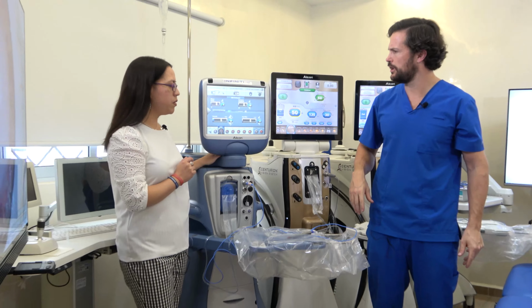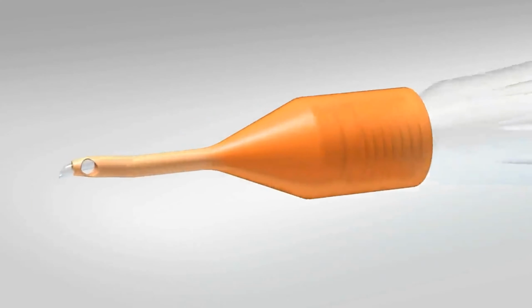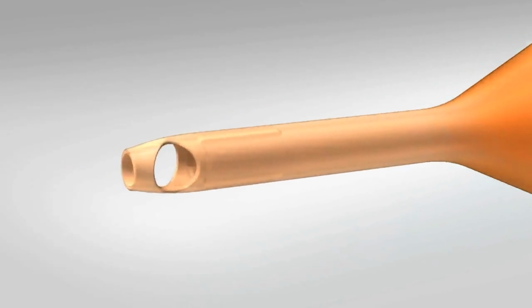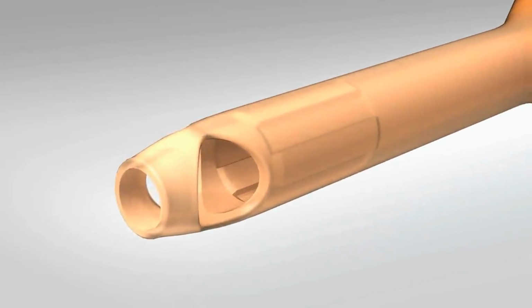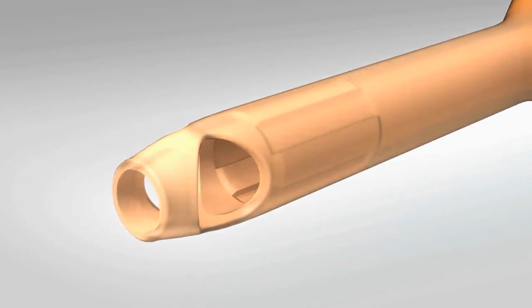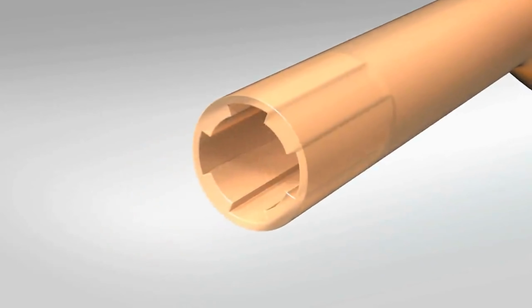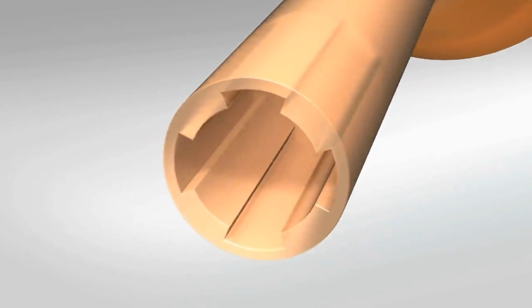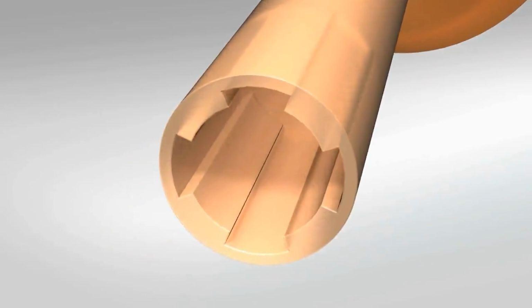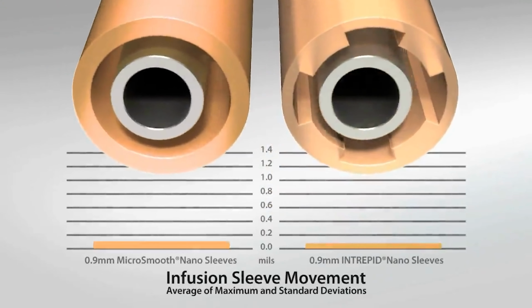Yeah, basically when we moved from longitudinal to OZil, it was a change in the way the tip was moving. Before we were moving in a forward and backwards movement, and now with OZil we have this side-to-side effect that reduces the repulsion and reduces the amount of energy that we deliver to the cornea as well. So that was the big innovation that we had in 2006 with Infinity. And after, we will cover a little bit more on the evolution, as Dr.